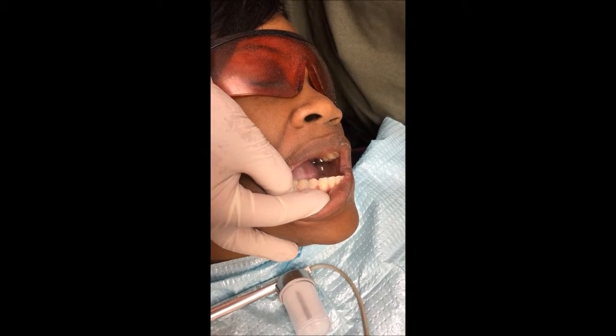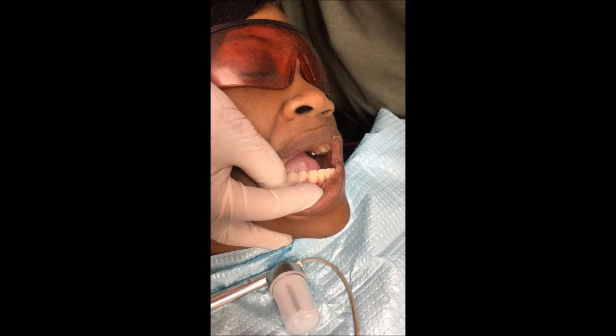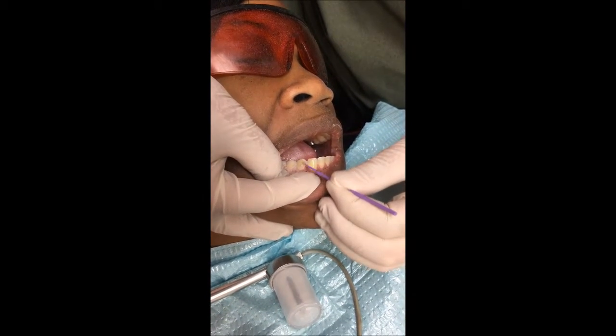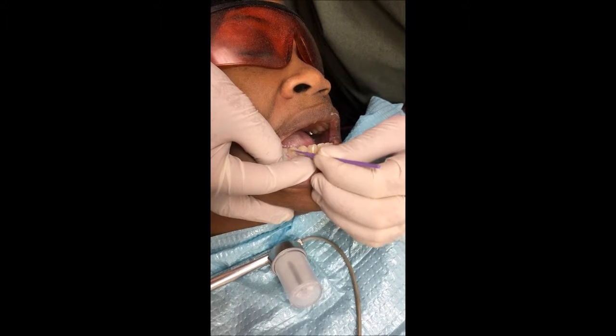They are now prepared for bonding. The last thing we're going to do is acid etch the surface of the teeth. We use 3M's LPOP. Lower right: 3, 27, 28, and 29.